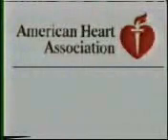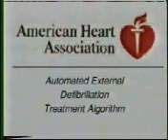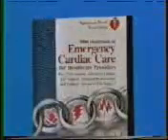This is based on the American Heart Association Automated External Defibrillation Treatment Algorithm, which is the guideline for emergency cardiac care before the arrival of the CPR team.